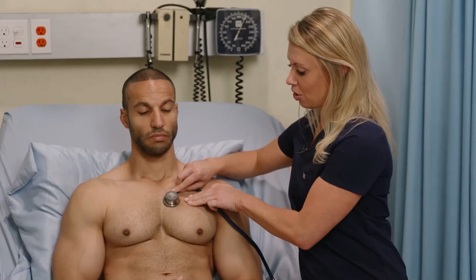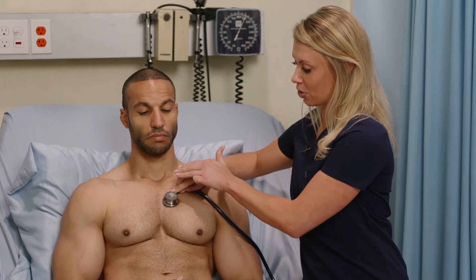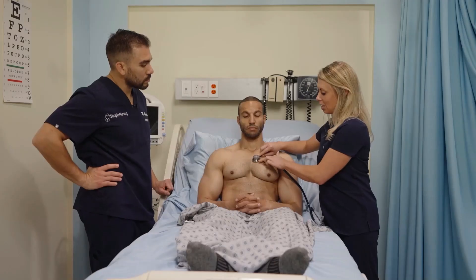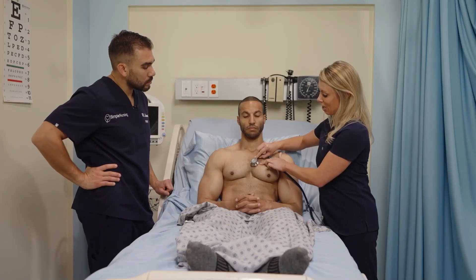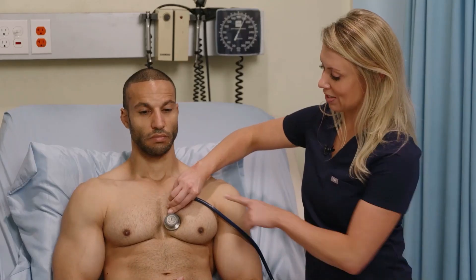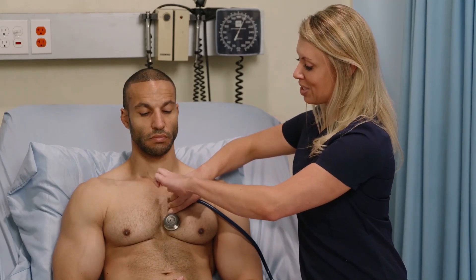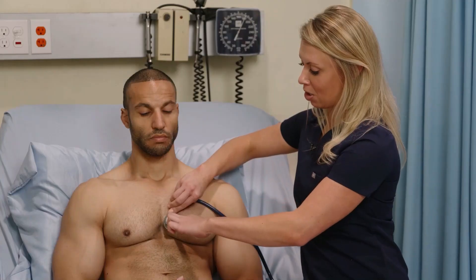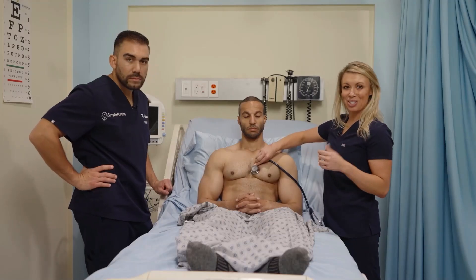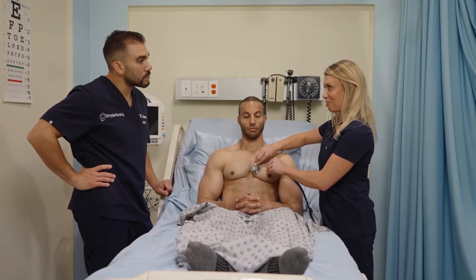Here's Erb's point, which is the third intercostal space, still at the left sternal border — just about one stethoscope head down from pulmonic. Then for the tricuspid valve, it's usually about the fourth to fifth intercostal space, still left sternal border. Note that we've been staying right along that border this whole time.